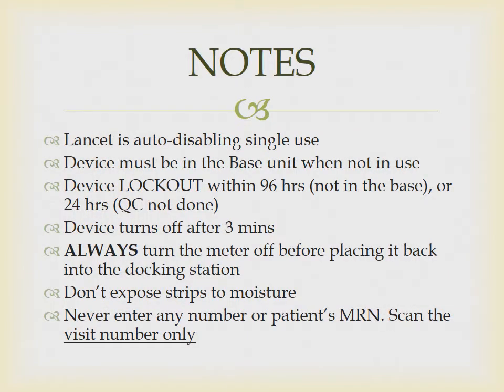The trained staff who will use this should remember that the lancet is auto-disabling, single-use. The device must be in the base unit when not in use. Device lockout occurs within 96 hours if not in the base, or if 24-hour QC is not done. The device turns off after 3 minutes. Always turn the meter off before placing it back into the docking station. Don't expose strips to moisture. Never enter any number or the patient's MRN, scan the visit number only.